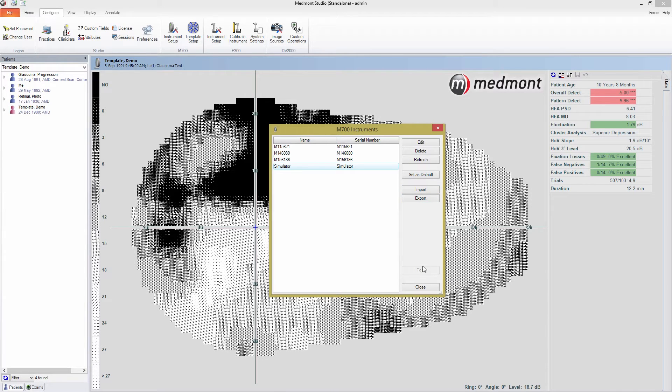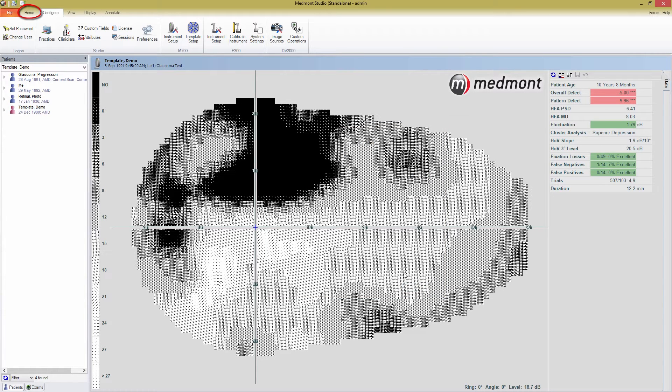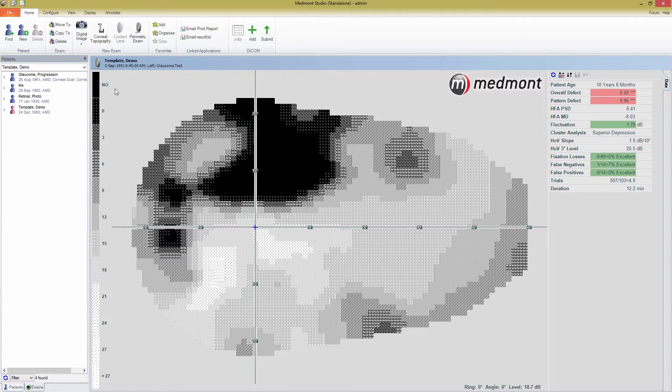To begin a test, return to the Home menu and look in the New Exam panel. If there is an option for a Perimetry exam, then you've successfully installed the M700 component of Medmont Studio.